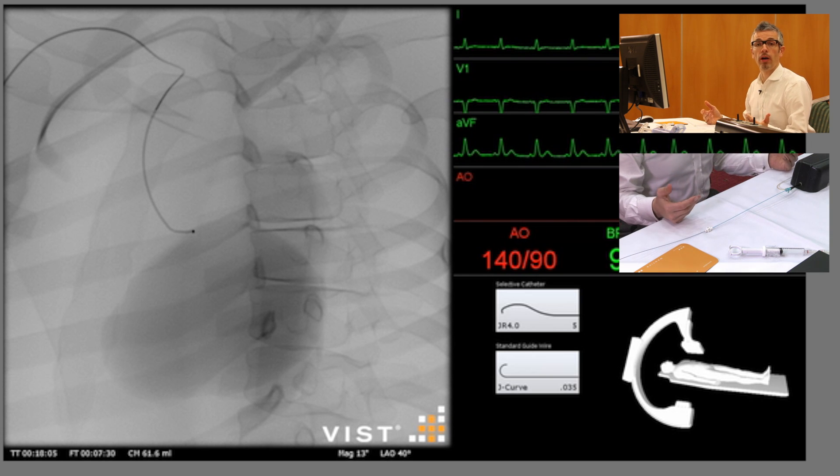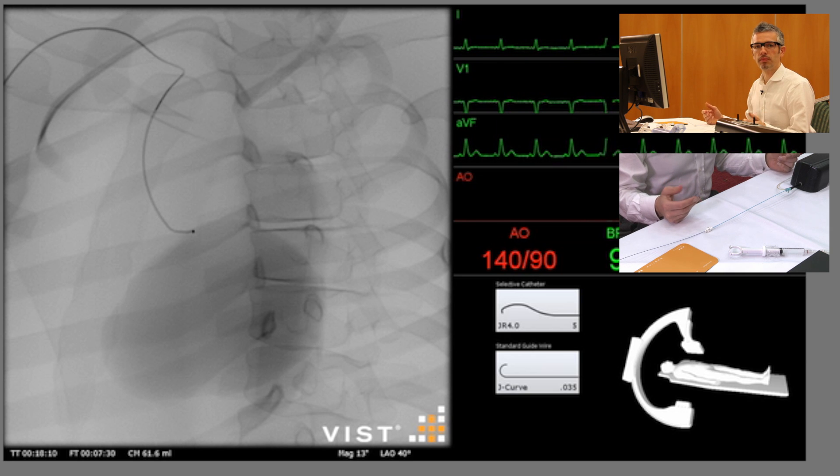In reality, this is where we remove the guide wire altogether, connect up our giving device ensuring that there are no bubbles in the system, and then looking to take some scouting shots.